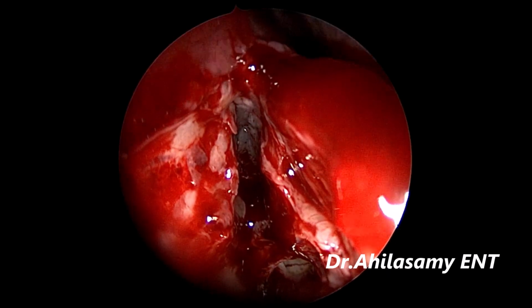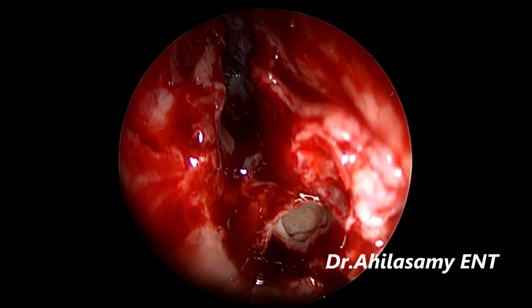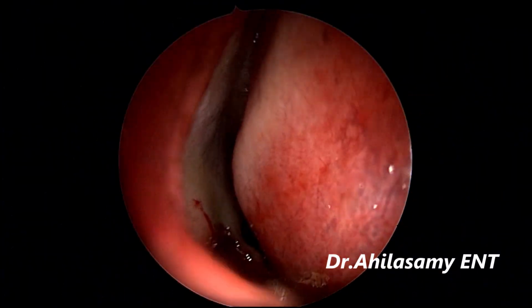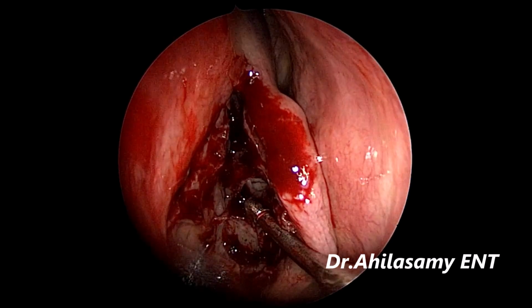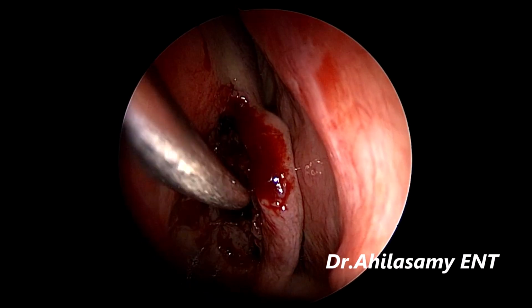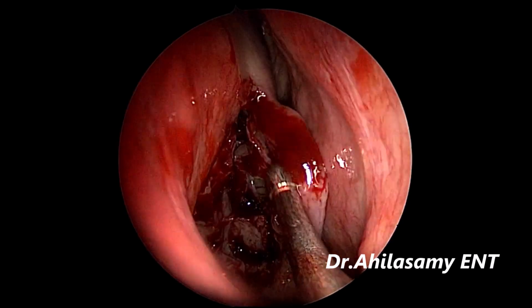So here the post-ethmoid cells are okay. So I will stop with that. I will not do the sphenoid. Already the CT scan is showing this sphenoid is good. In this case, the anterior ethmoidal artery is not dehiscent, so I will not be showing it.